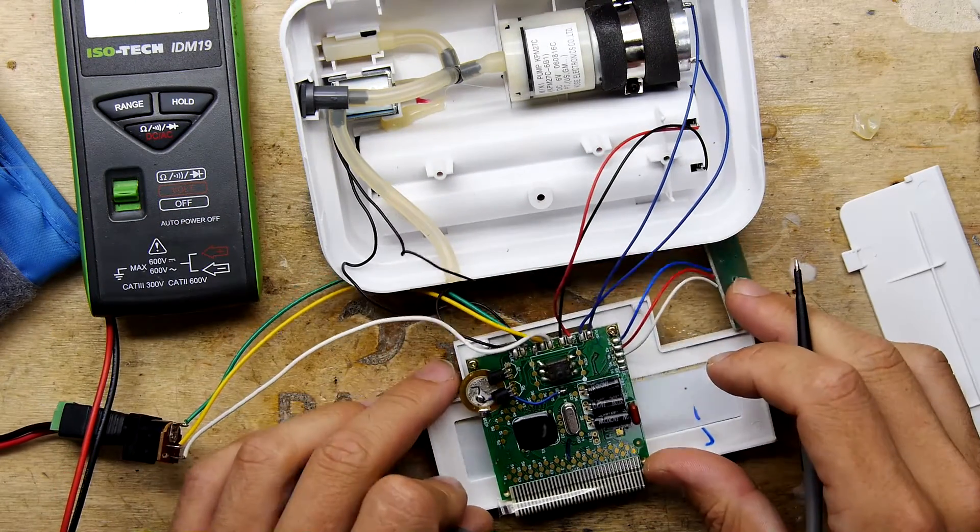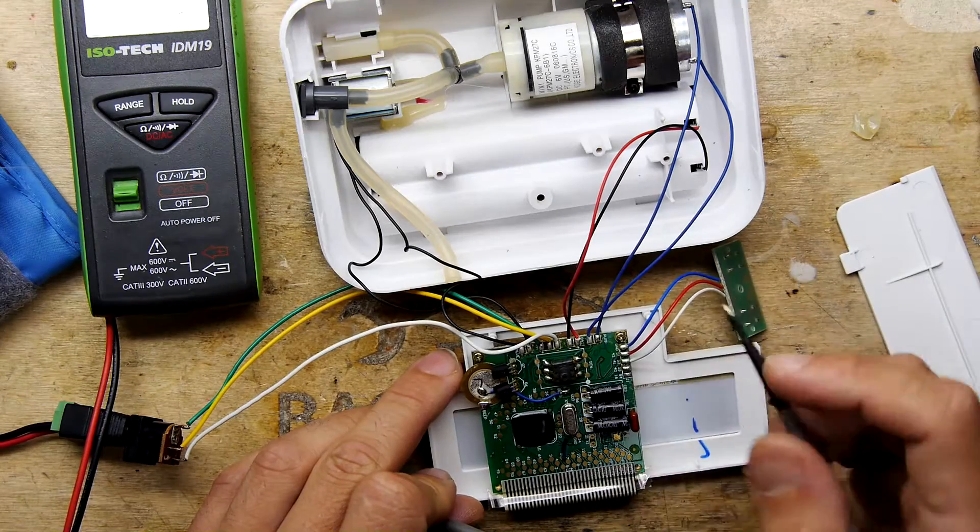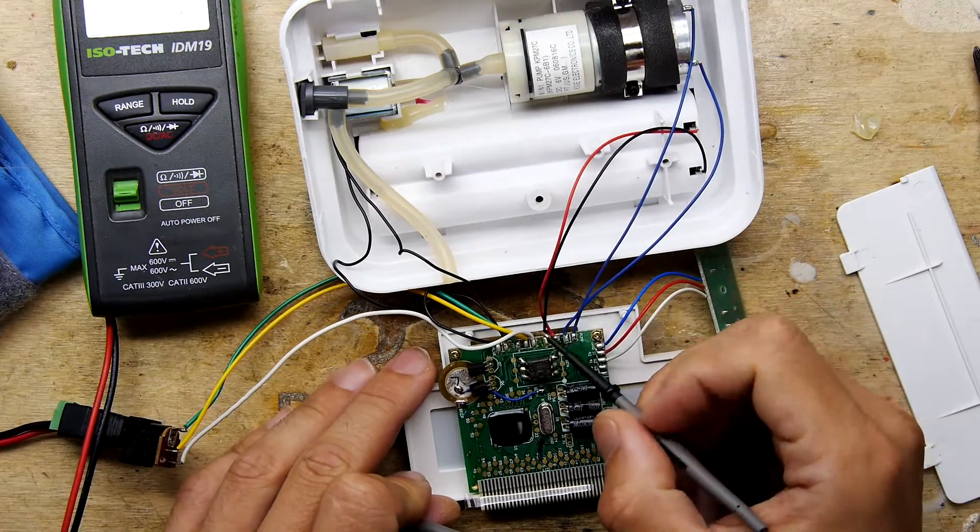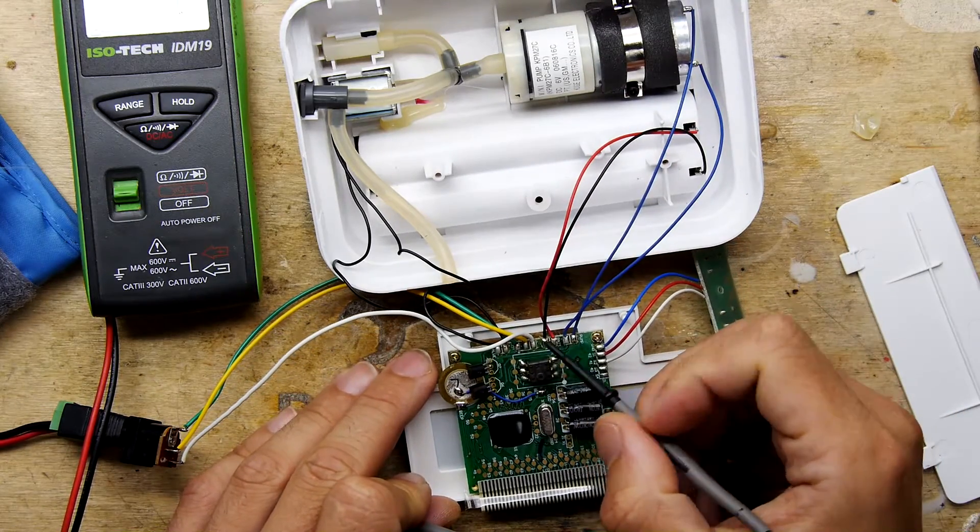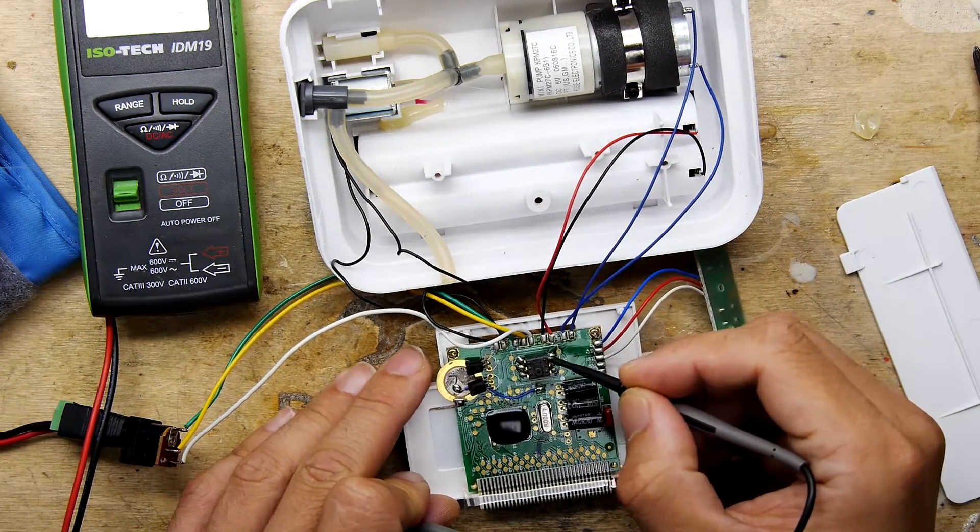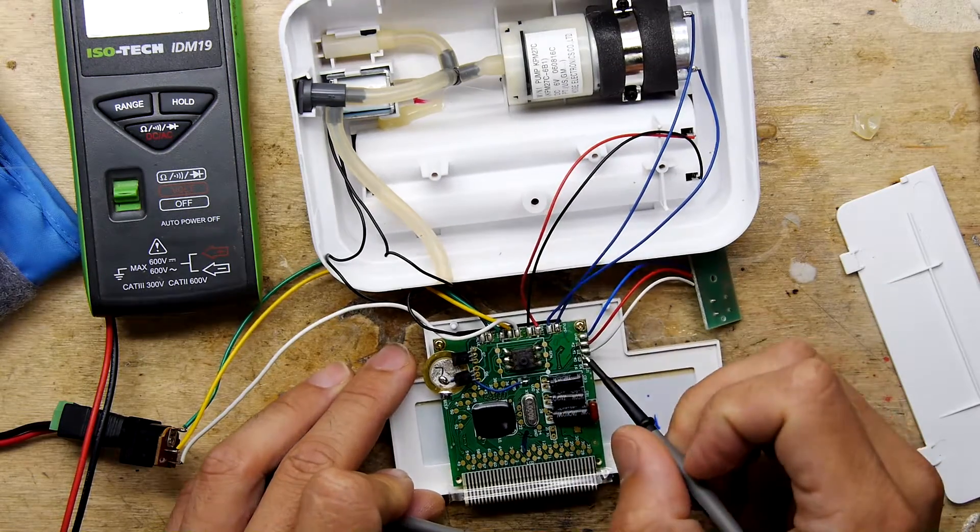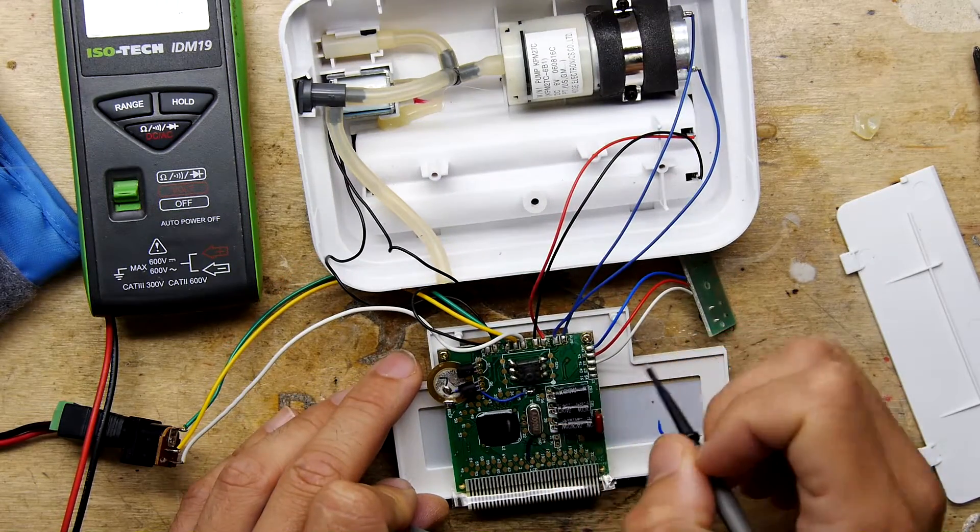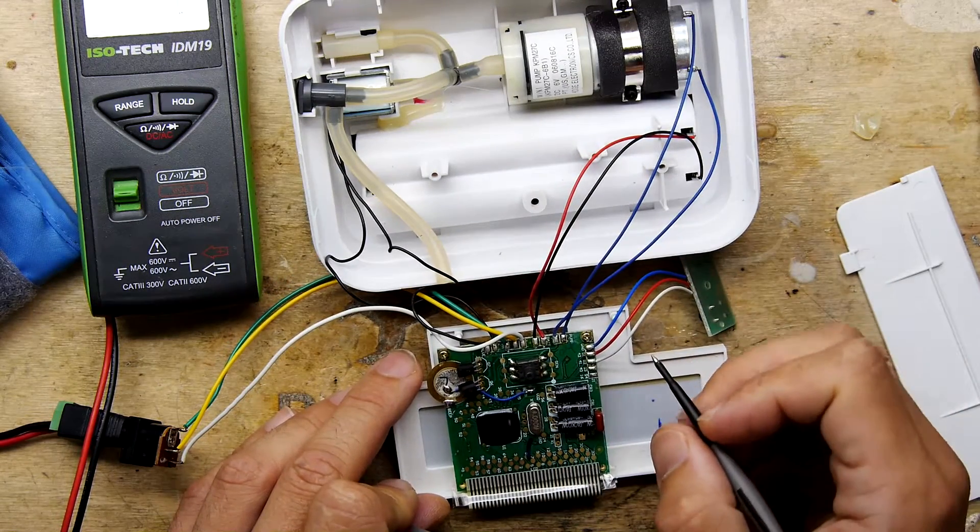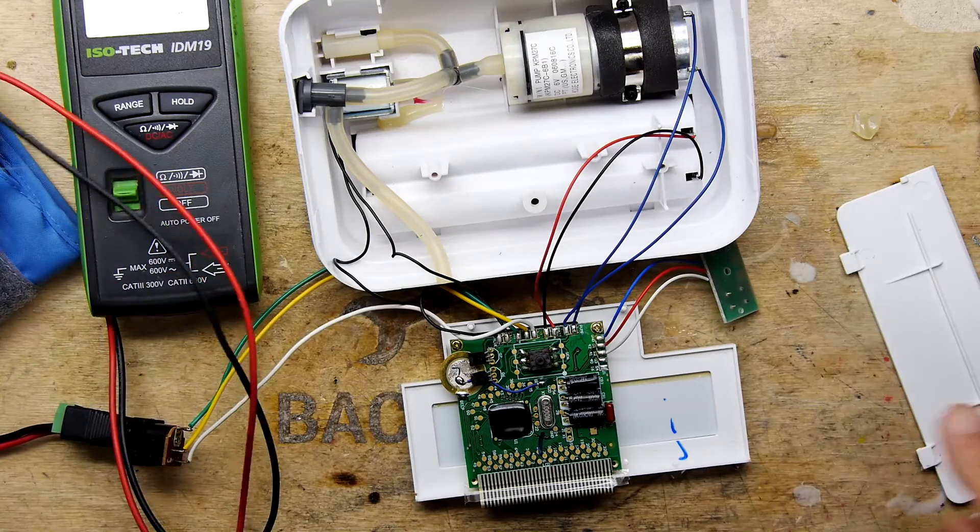So, but there is definitely power going there. Oh, the yellow wire, that gets closed to allow power from the battery, looking at the circuit here. So that's just a kind of a battery switching thing.